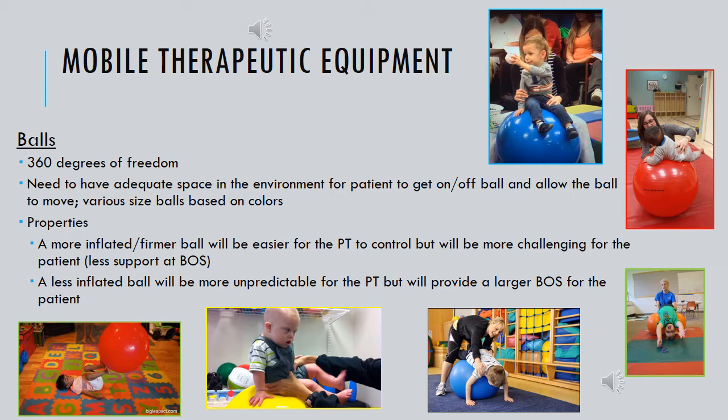The pictures on the slide show a variety of ways in which you might choose to use a physio ball during a session. It is certainly not an all-inclusive list, and we'll challenge you during lab to think of all of the different ways in which you could incorporate use of physio balls into your sessions.